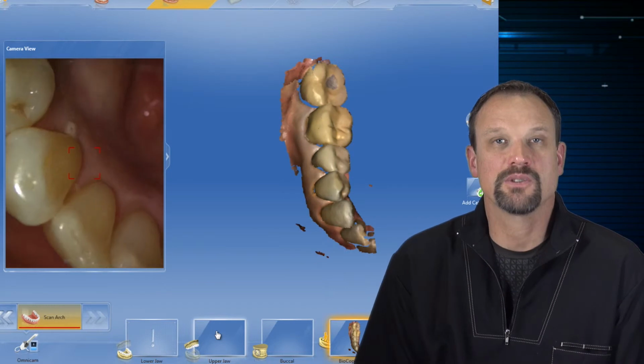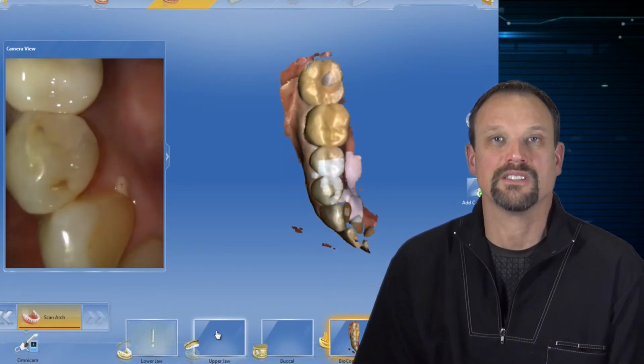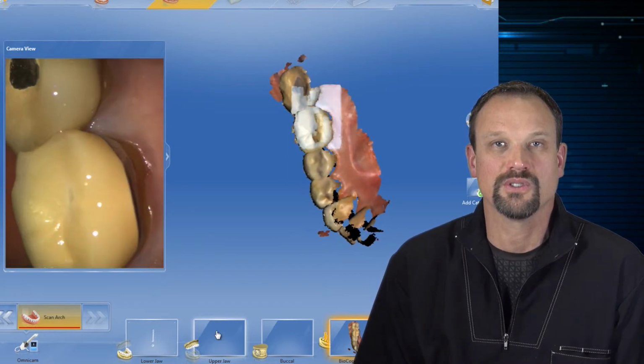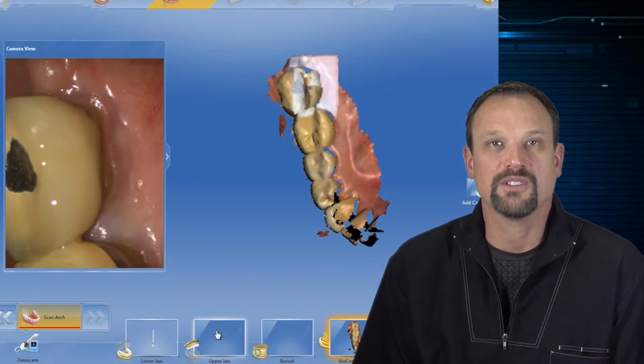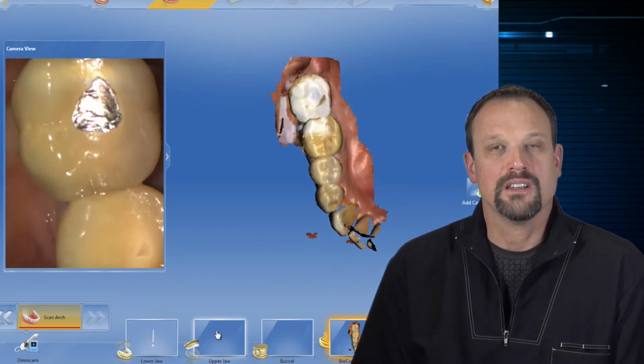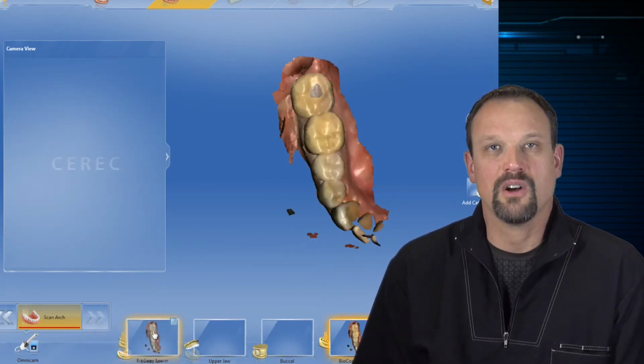impression. In this particular case, we're replacing the porcelain fused to metal crown on number 30, and we're going to use the contours of number 30 to make the shape of the final restoration, which will be in EMAX. So again, we are waiting for anesthetic. All we have to do is duplicate this model.